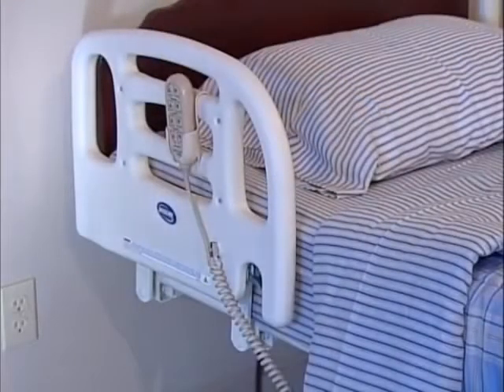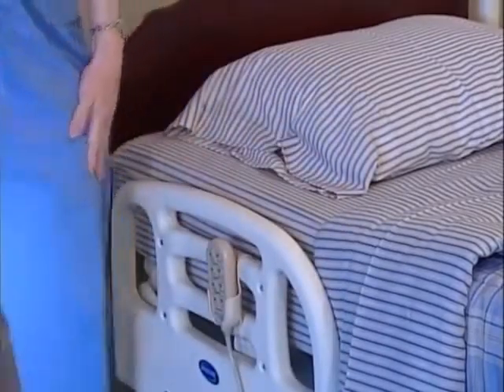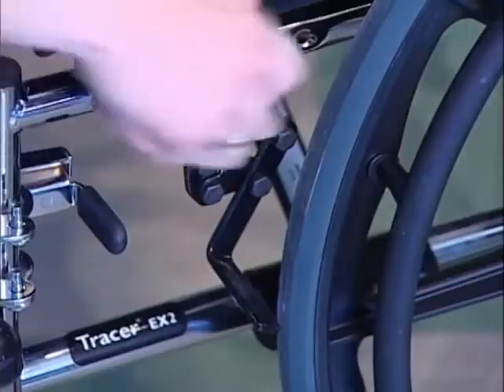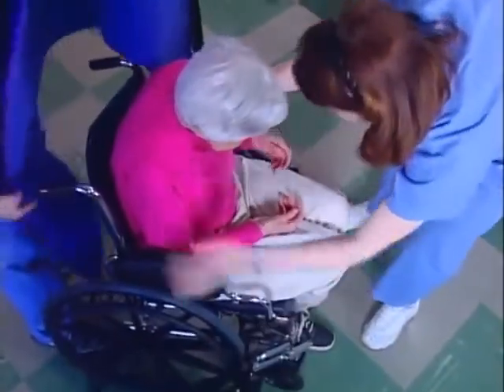Before performing the lift, engage the brake on the bed, and then lower the rail on the side that will be receiving the lift, and make sure that the bed is at a safe working height. Move the resident and wheelchair as close to the bed as possible. Engage the wheel locks on the wheelchair and move the front riggings out of the way.